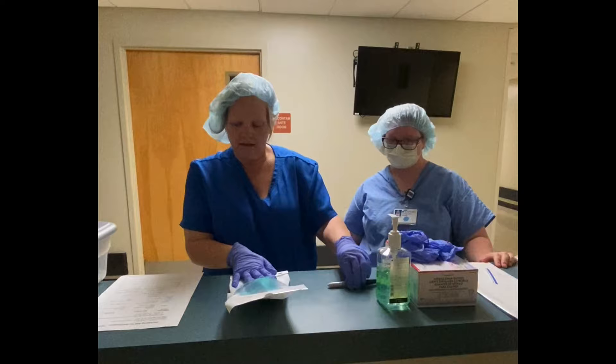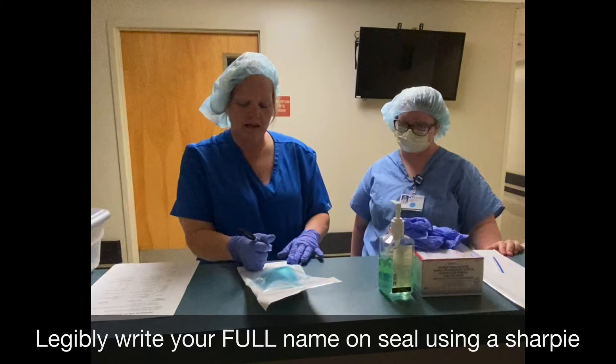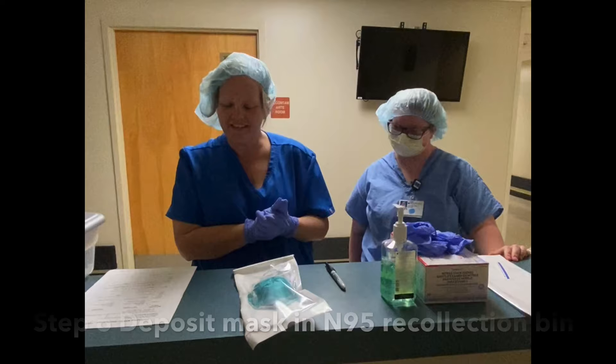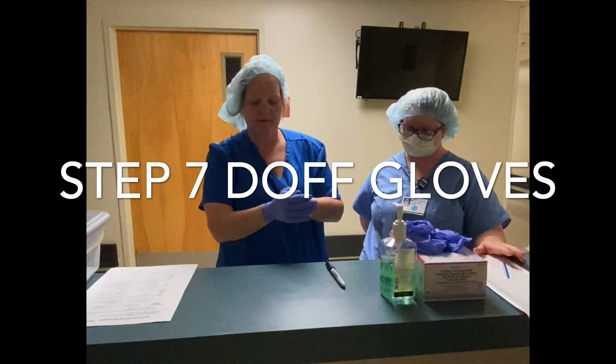Important step number five, label your mask. An important key point: make it legible. Number six, deposit the mask in the N95 recollection bin. And important step number seven, doff your gloves and perform hand hygiene.